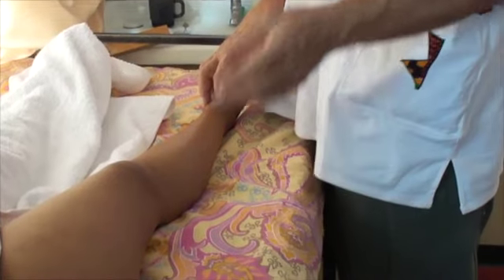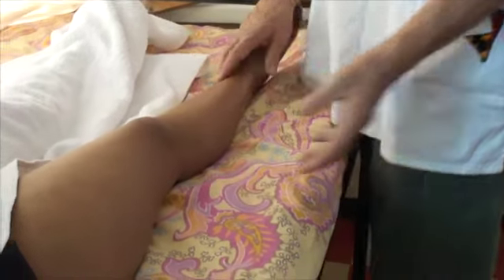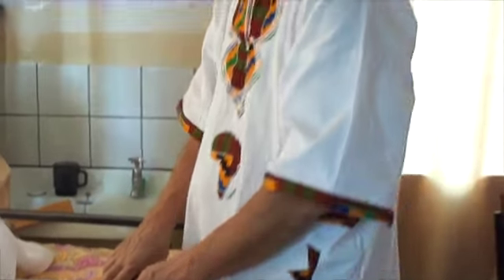Together with the medicine which makes the blood more fluid, and this gentle compression, and just a simple type of walking, you will prevent that this deep venous thrombosis will become huge or get worse. With lymphedema, you can bandage them as well — gently, but very regularly.